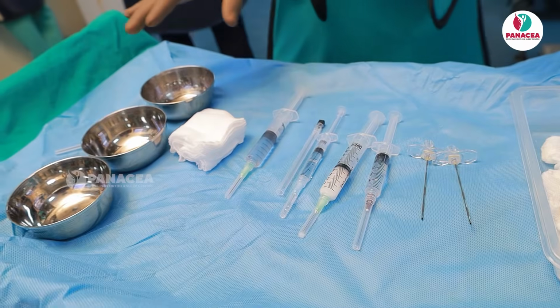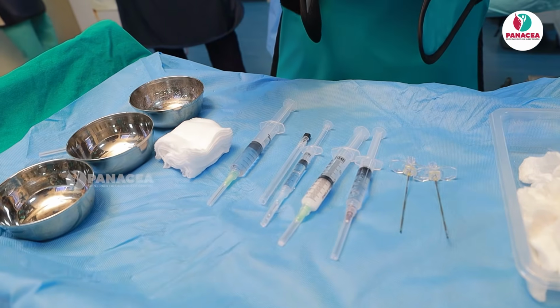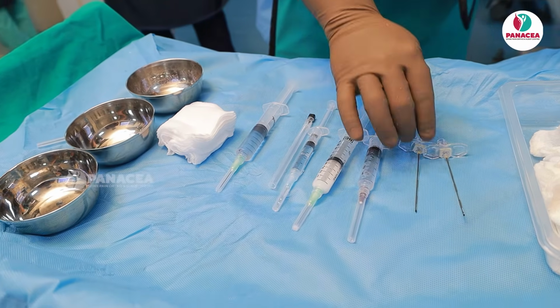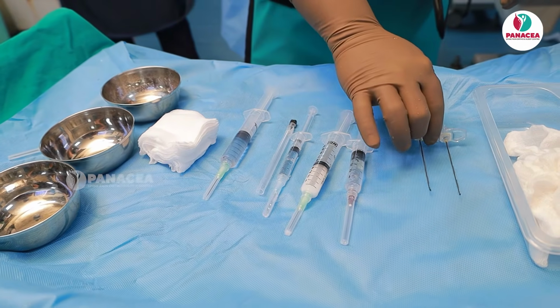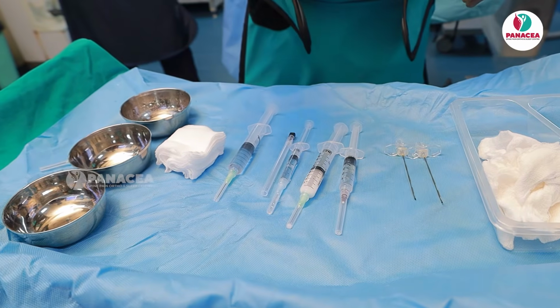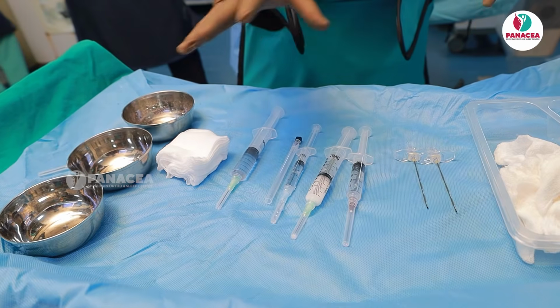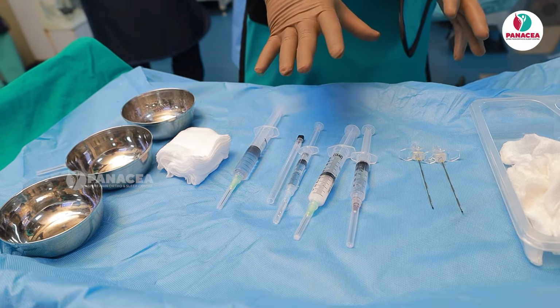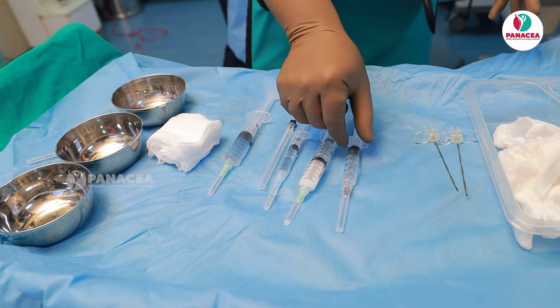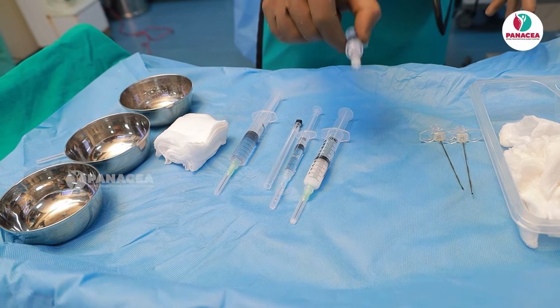If you see here, this is the armamentarium required for an epidural injection, transforaminal epidural, that is the infraneural approach. You see here, you've got 2 Tuohy needles. I don't use these Tuohy needles for the procedure, but I have used them as radiological markers in order to reduce the radiation. I place 2, 3, 4 radiological markers to know exactly the target.